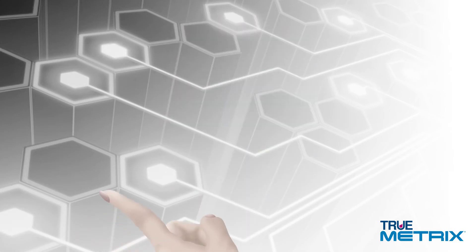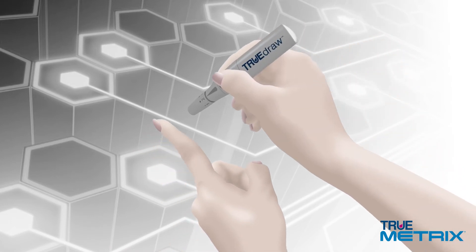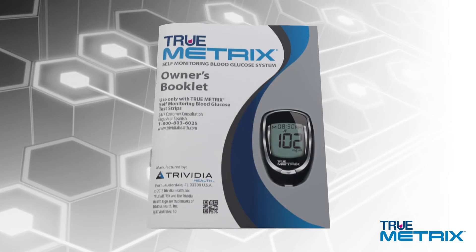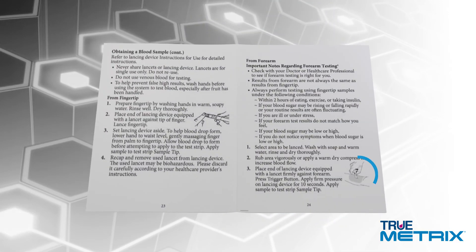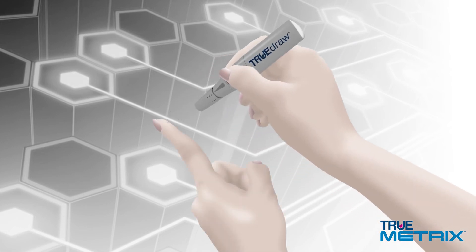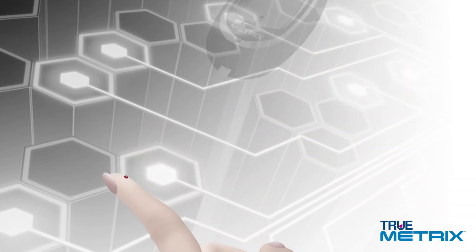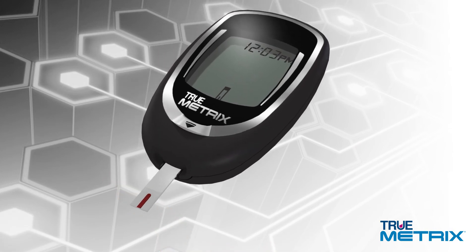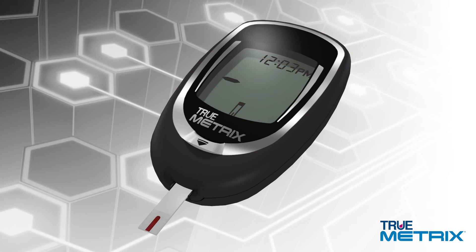Next, using your lancing device, obtain a drop of blood from your fingertip. If you prefer to use an alternate site, refer to the owner's booklet to learn about this type of testing. Make sure to allow a small blood drop to form. Then touch the test strip sample tip to the blood drop and hold it there until the meter beeps. Dashes will appear across the display to indicate that the meter is testing.